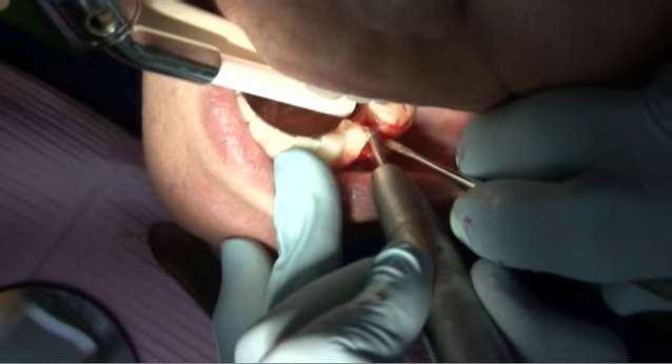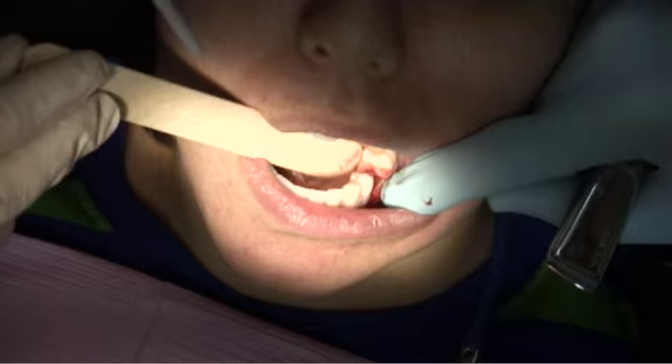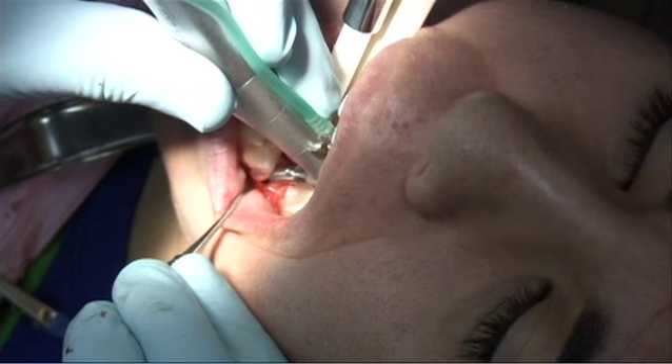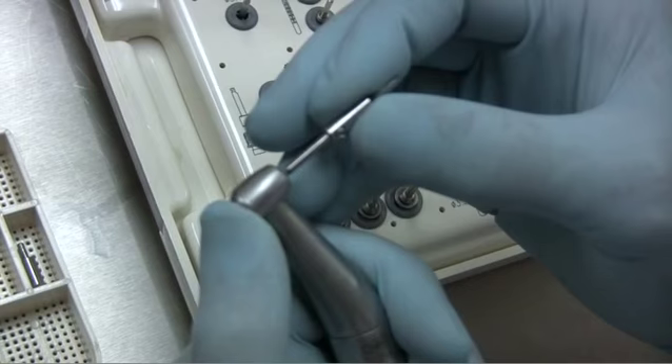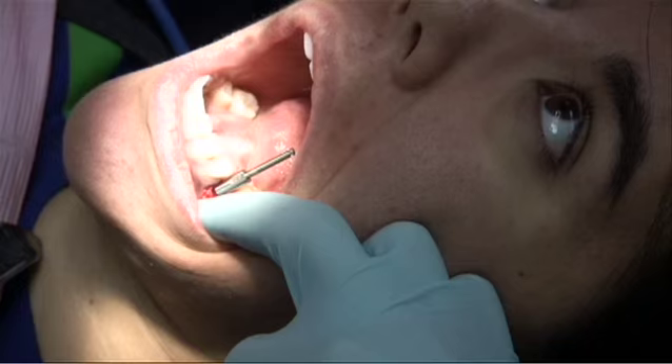When satisfied, the guide is inserted and the osteotomy is started with a round burr. The osteotomy with the O20 round burr and drill stop is started exactly in the center of the acrylic channel. There is no need to change tubes and sleeves because the channel in the drill stop will control the drilling axis. Next, the pilot drill is inserted to the slot. The tip of the drill engages the opening created by the round burr.